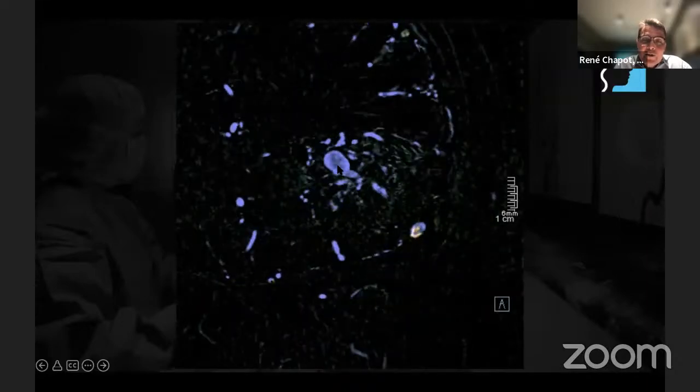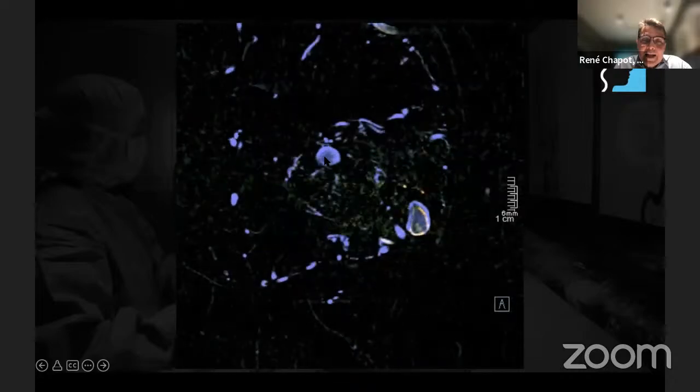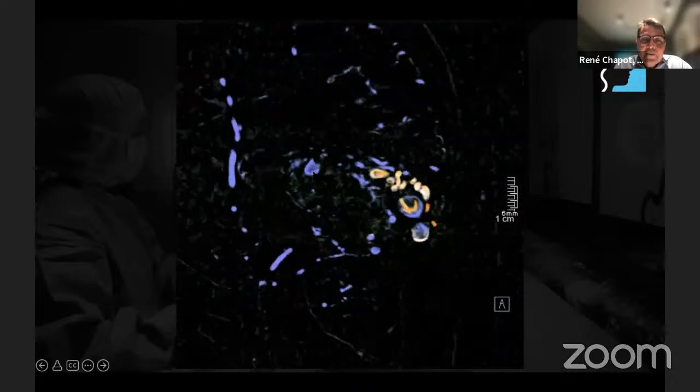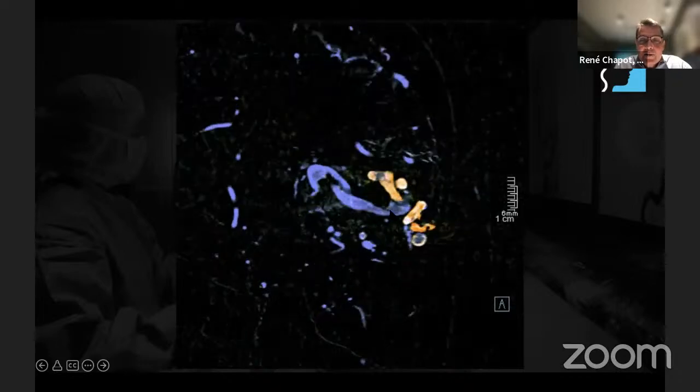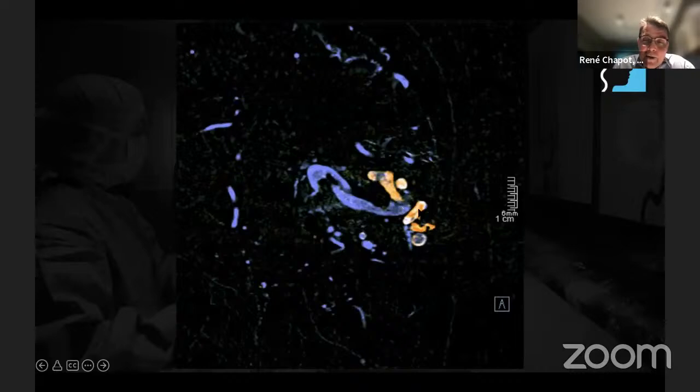Here's the AV shunt, the primary vein. You see here that large outflow vein. Downstream, downstream, downstream, you go here. Here is some Onyx that was lost during a previous injection. And you go down, and here you arrive at this little shunt that we're just facing. Imagine if we would embolize from here and occlude that vein, the AVM would go up. It would just bleed. So understand, this is crucial.